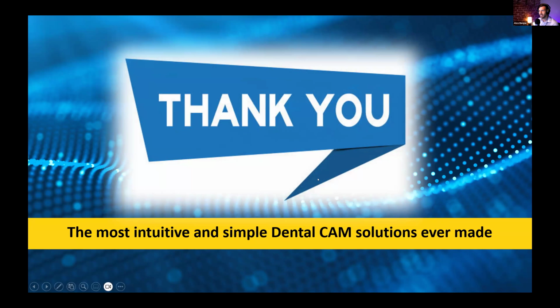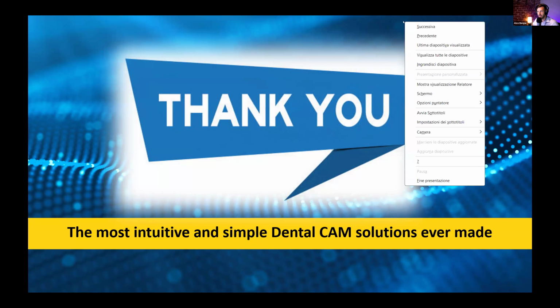Yeah. Thanks, Jimmy. He just mentioned that if you have any questions, go ahead and we'll take your questions. We can go all the way to 11:30 if needed. There was one question in the chat, but it is actually a mailbox question. For that person, I'm just going to say we're answering that live, asking about undercuts on a bite splint not being able to fit using mailbox. We're happy to answer, but we recommend you reach out to our support.